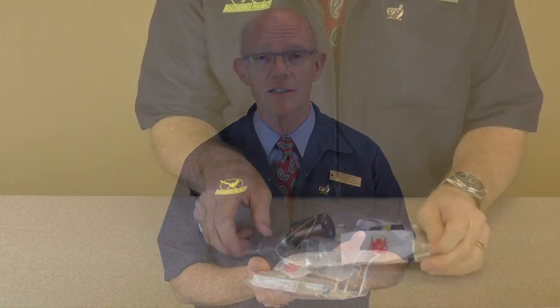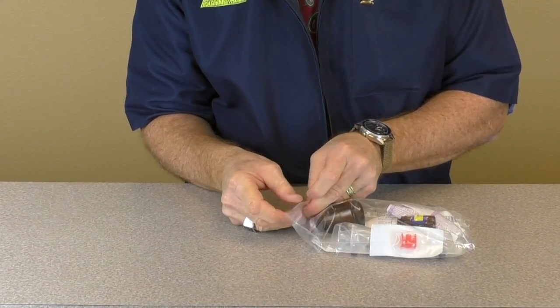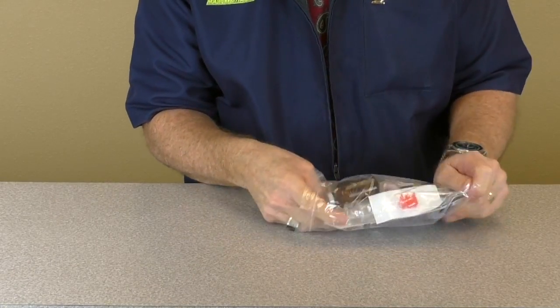And this is how the kit comes to you — all the components you need are inside the bag. First, find a clean area away from wind sources and people traffic.